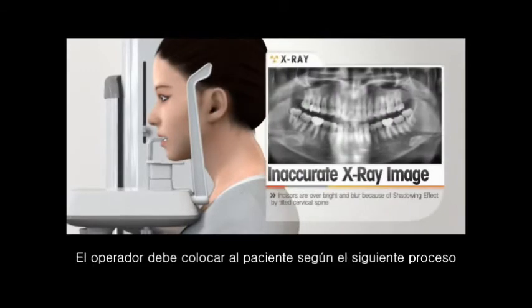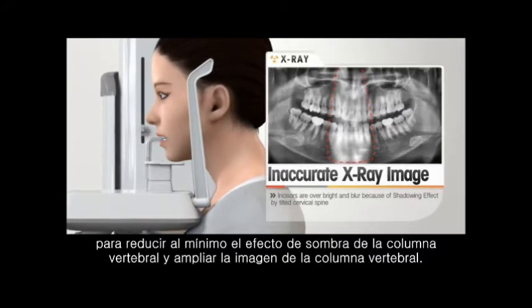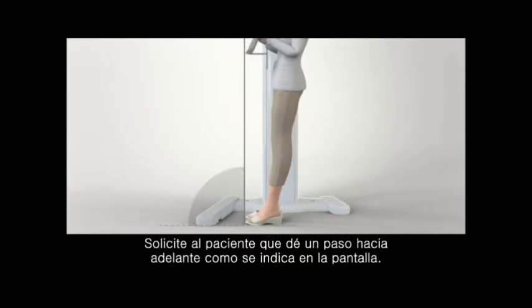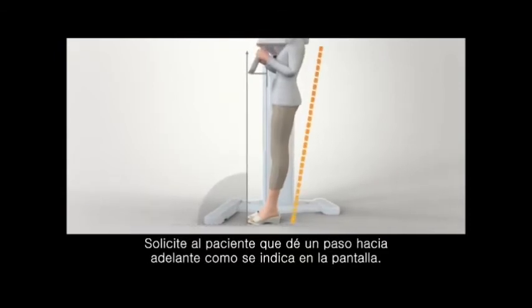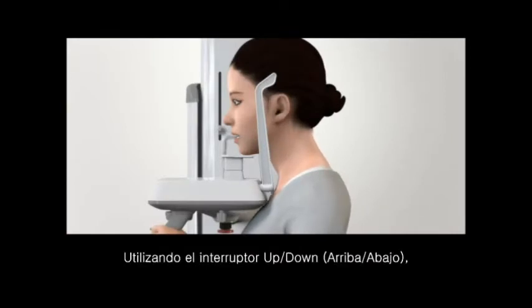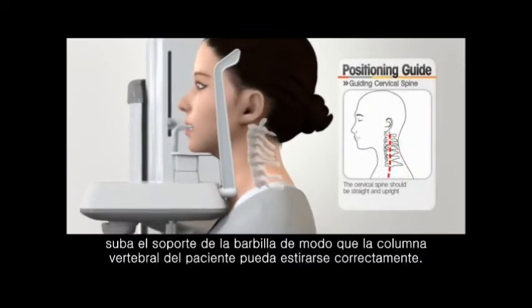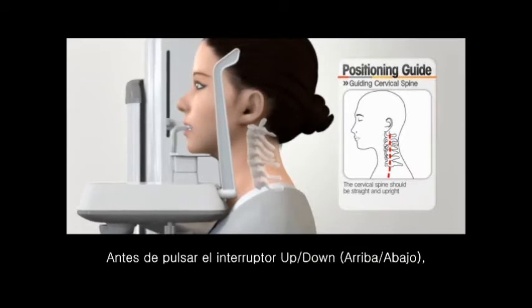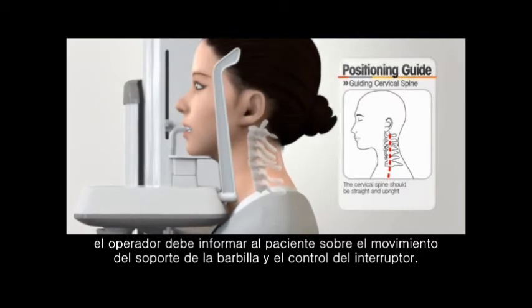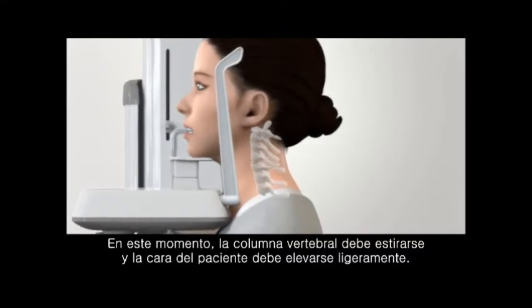Operator should position the patient according to the following process to minimize the shadowing effect of the spine and stretch the spinal image. Ask the patient to step forward like the screen. Bring the patient's chest close to the handle frame. Using the up-down switch, raise the chin support so that the patient's spine can be properly stretched. Before pressing the up-down switch, the operator should inform the patient about the movement of the chin rest and control the switch. At this time, the patient should be stretched up and the patient's face is raised slightly.